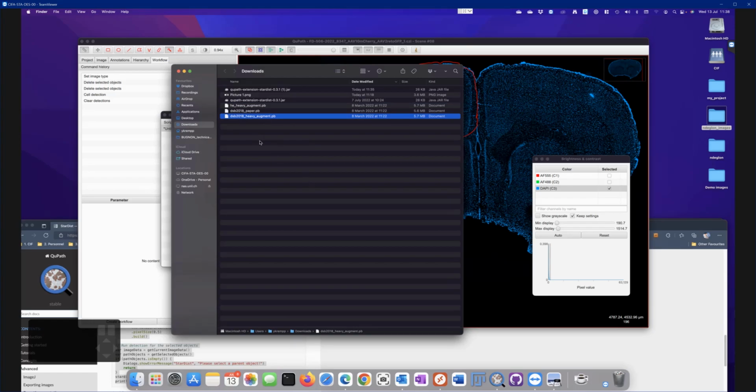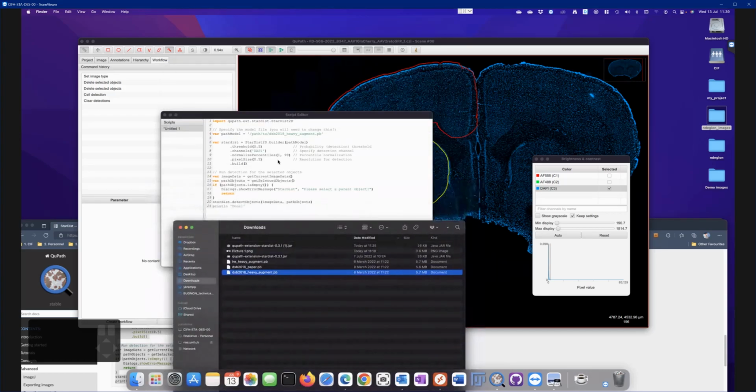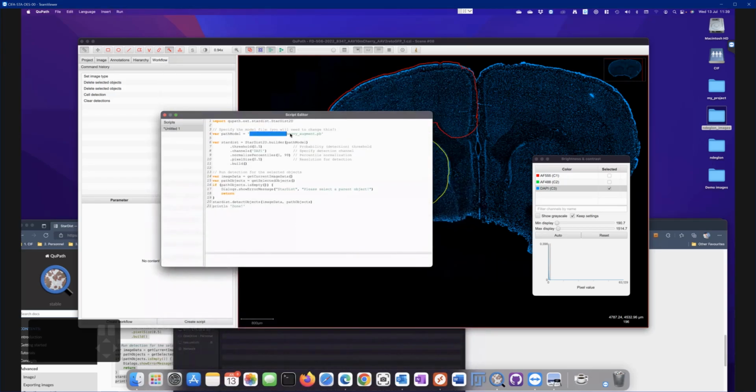The easiest way, if you have enabled the shortcuts here, it's a preference in the Finder tool that you can enable, is to right-click here and copy the name of the file as a path name. So it's really fast, and you can just replace this here, paste, and then you get directly the right path to the model.